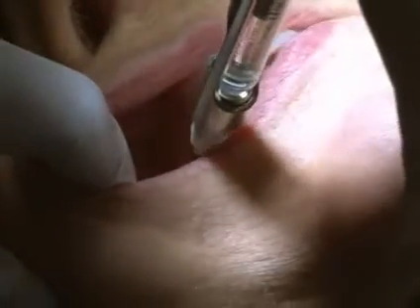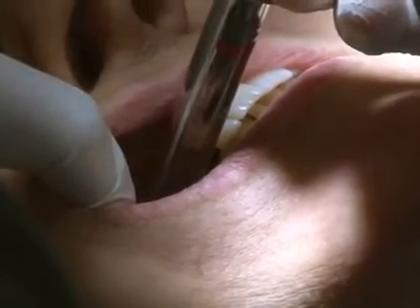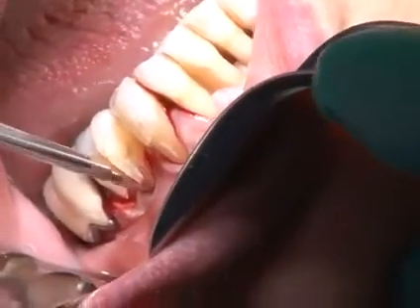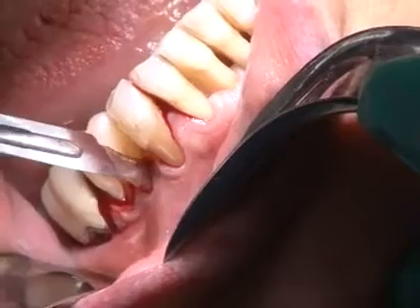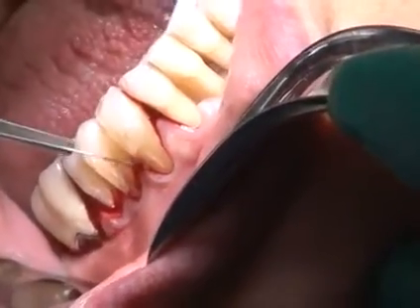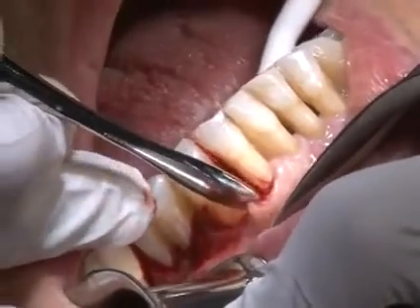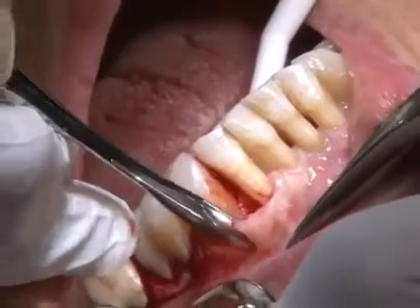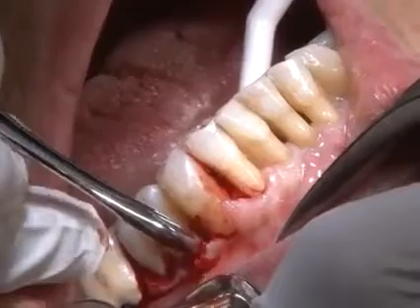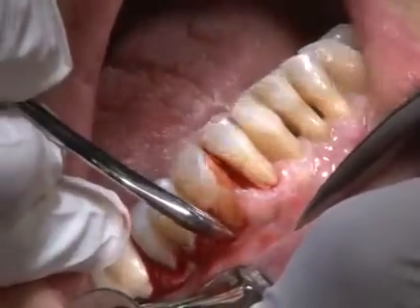After achieving profound dental and soft tissue anesthesia, the typical incision is an inverse bevel incision. This type of incision removes excess tissue and thins the mucoperiosteal flap, which eventually allows the gingival margin to be placed more apically. With the use of periosteal elevators, most commonly a number 9 Molt, full-thickness mucoperiosteal flaps are raised buccally and lingually to gain access to the root surface and osseous defects.